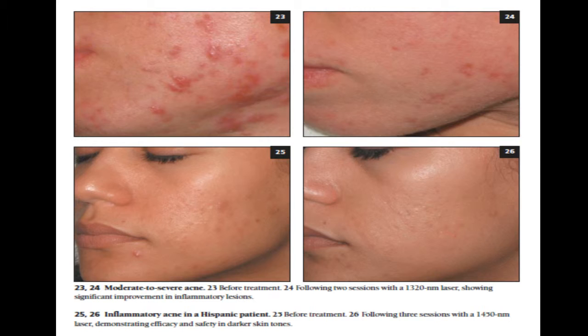In the treatment of acne, the initial fluence is typically set between 12 and 18 J/cm². A test firing is performed and fluence is then adjusted to reach the required temperature range, as displayed on the light-emitting diode screen. 3 to 4 passes are usually undertaken, although no randomized controlled trials have been performed to document greater efficacy of multiple passes in the treatment of acne vulgaris.